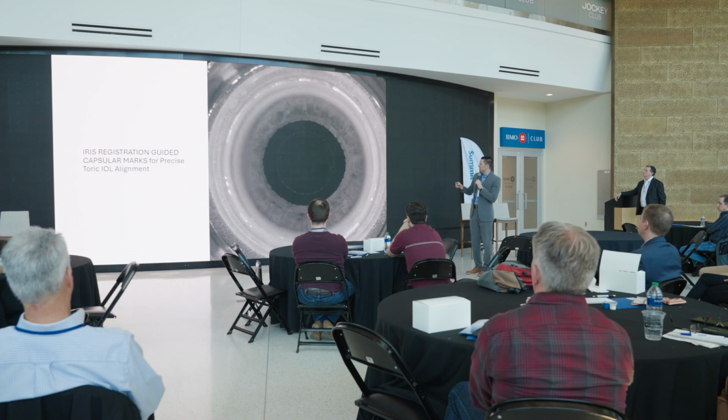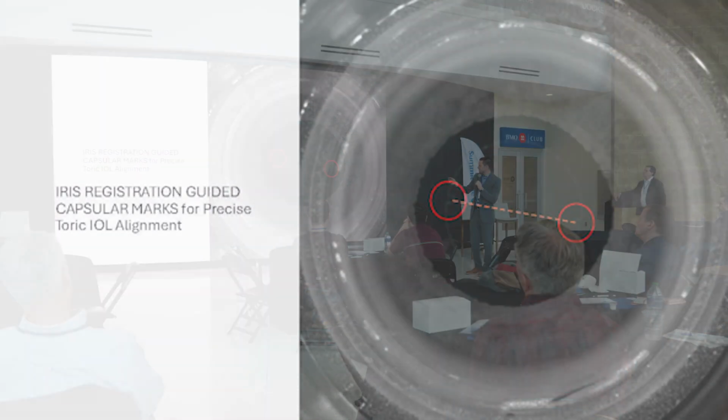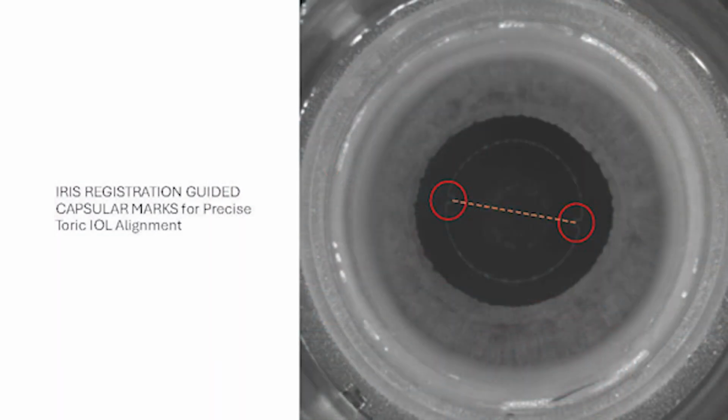So Dr. Vukich already mentioned the nubs as well. If you look right here, there they are. We use these to guide our toric axis markers. Dr. Vukich, how do you normally do toric markers in the operating room?